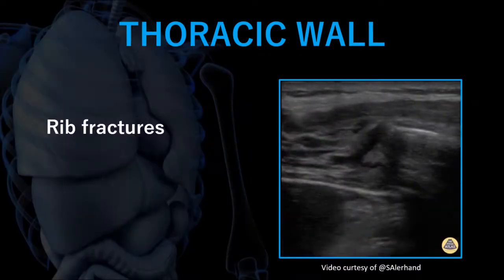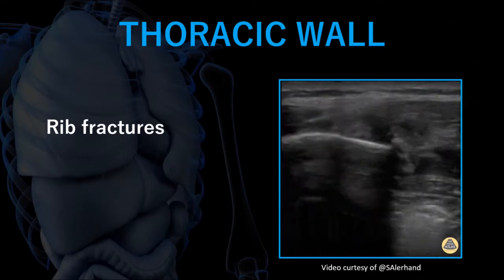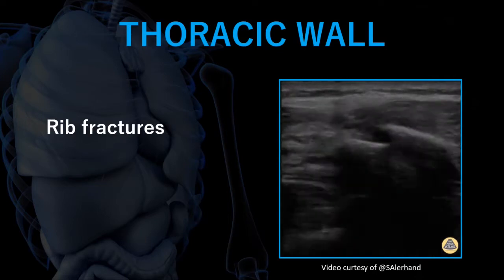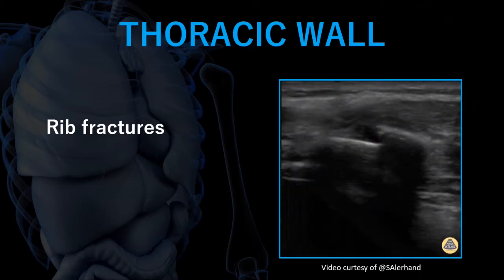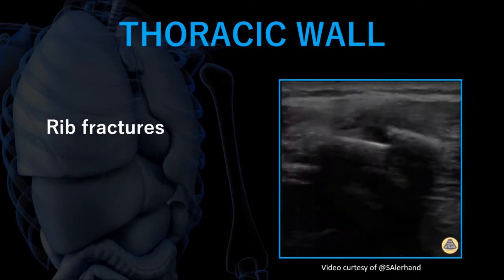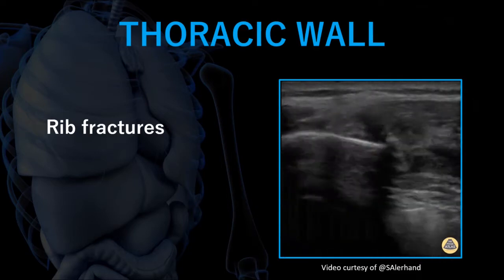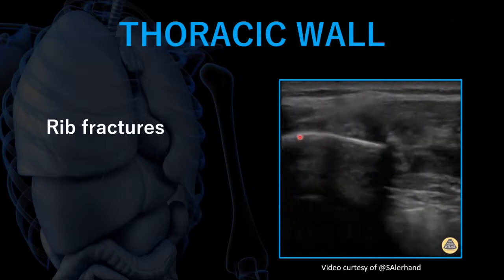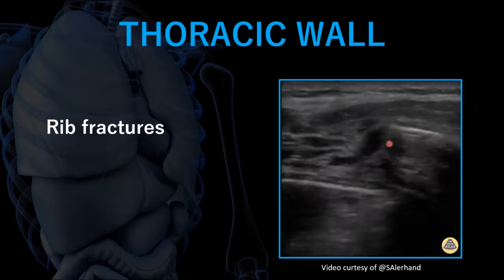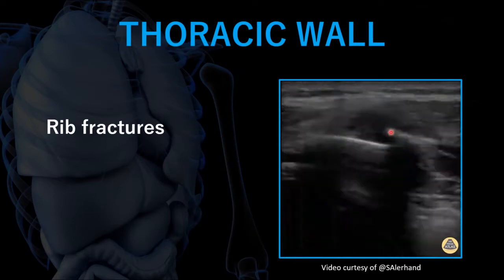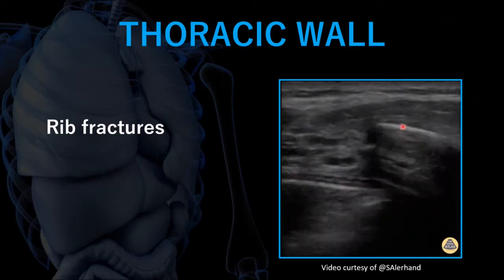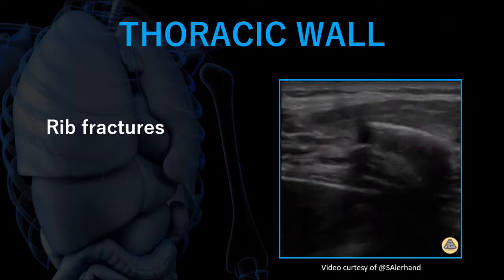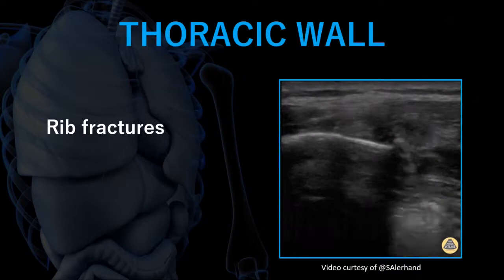When we scan the thoracic wall with ultrasound, what can we see? One of the easiest things to spot is scanning over the right place - perhaps where the patient indicates pain or where there's erythema or contusion on the skin. You can quite easily see rib fractures. On this image, this structure here is the rib. You can see there's a stepwise break - one section of the rib coming into view here, and another lower section. You can track these rib fractures quite easily.